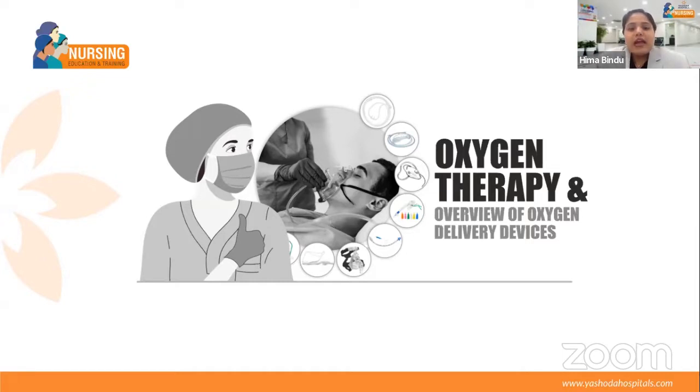I'll make sure that you come to know all these 5 steps by the end of the session. These steps are very important to initiate oxygen therapy. Firstly, we need to assess the need for oxygen therapy. Then you need to identify the type of hypoxia. Based upon the status of hypoxia, we need to initiate oxygen administration using the oxygen delivery devices. Then don't forget, when the patient is on oxygen therapy, we need to monitor continuously and not neglect the complications.